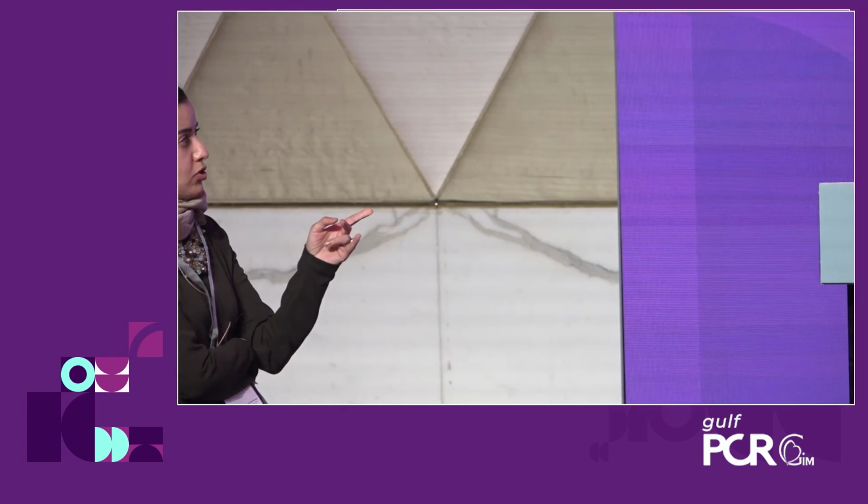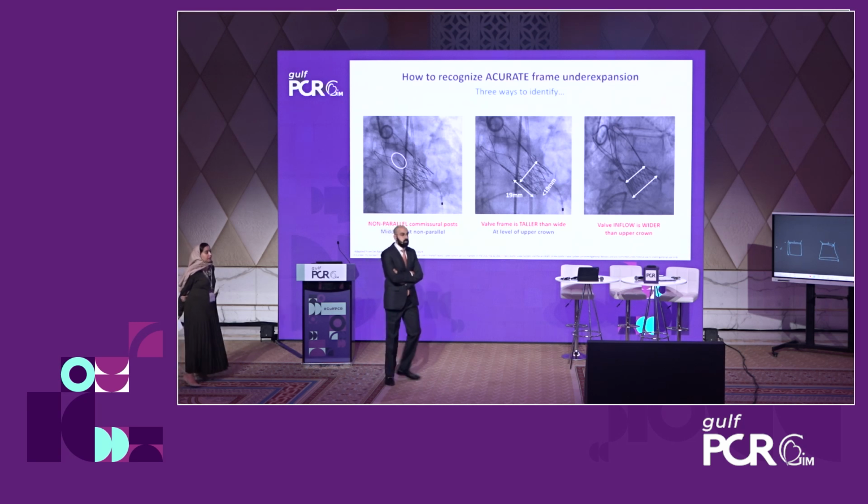Unexpected results. A very good point, because you also mentioned that when they did the enrollment, first of all, there are a lot of sites, and each site was doing 1 to 3 per how many months? So one every 3 months, yeah. So clearly, not everyone is on the same page. If there are a few centers doing only a couple of cases throughout the study, they're probably not doing it the correct way. And most of the platforms don't require this much pre-dilation, so they're probably good implanters. It's just they're not used to this platform, which is a bit different than others. Exactly. Any questions from the audience?